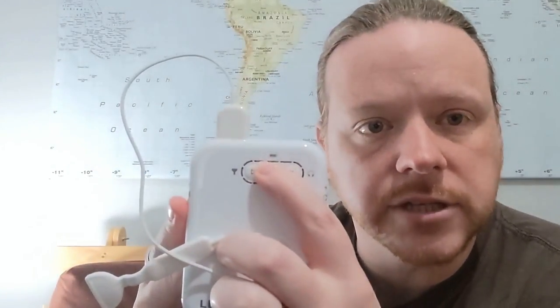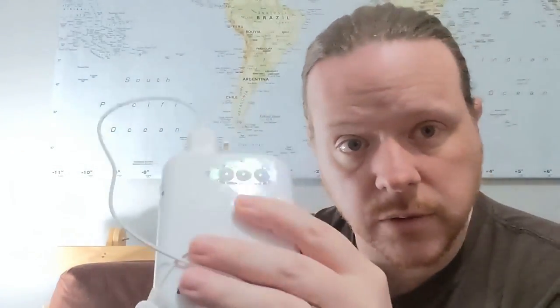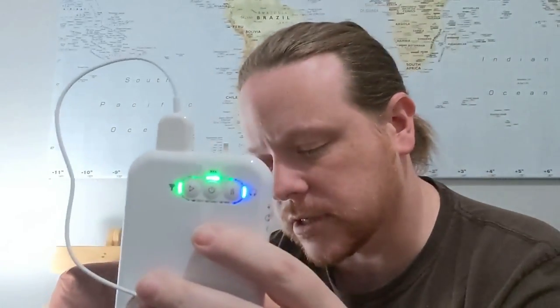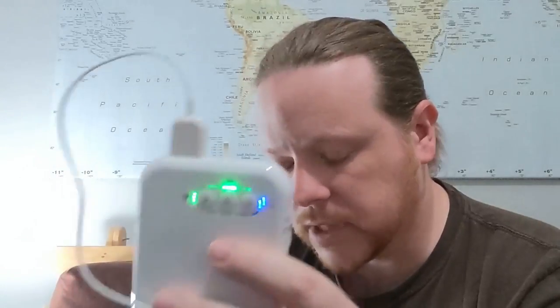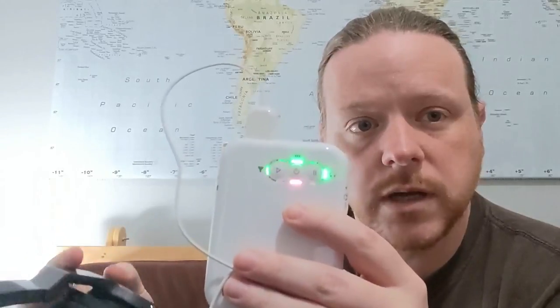So what I'm going to do is turn on this device. They show you how to do all this when you receive it. I wasn't allowed to play with it until I had the introduction. So that's saying that it has the tongue tip plugged in.